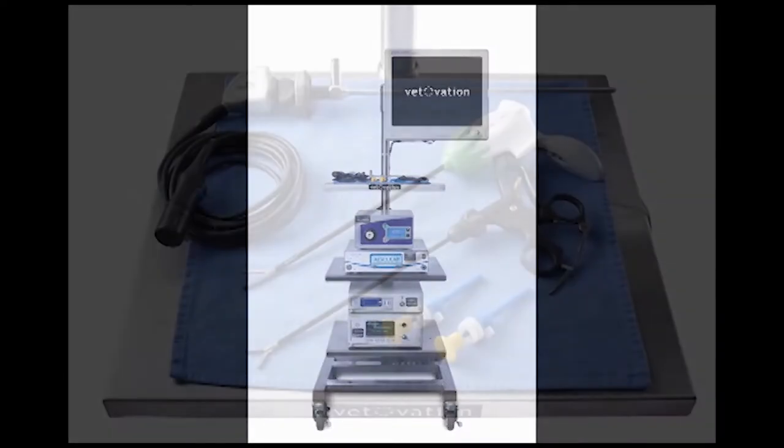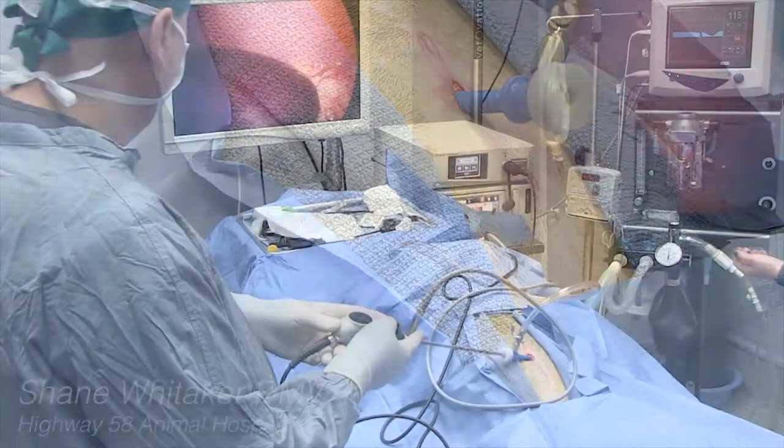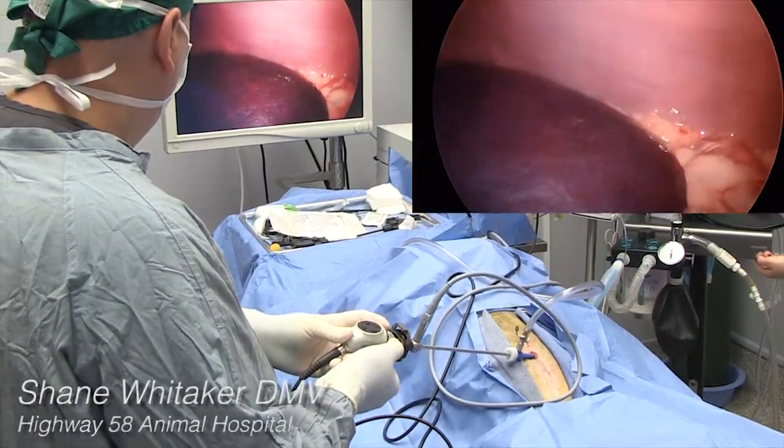The Vetovation laparoscopic system is easy to use. We provide in-hospital training and support to keep you in your comfort zone. Most trocars are placed in the linea alba.